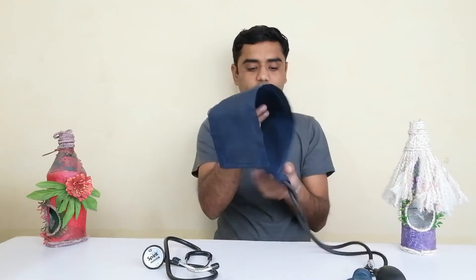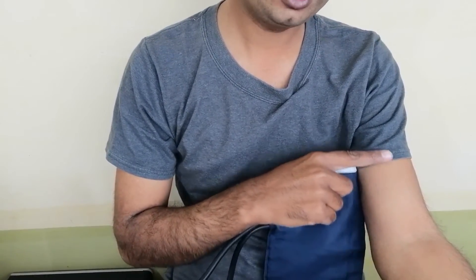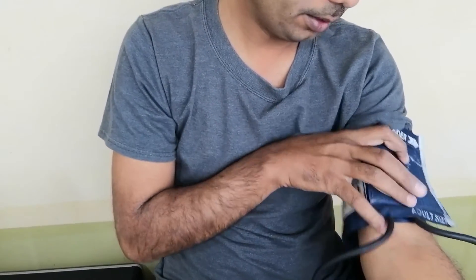First we tie the cuff to the arm. This is our cuff — we tie it on the arm. Before tying, note that there should not be any kind of cloth on the arm; the arm should be bare. However, very thin fabric is acceptable, but it is better not to have anything on the arm.